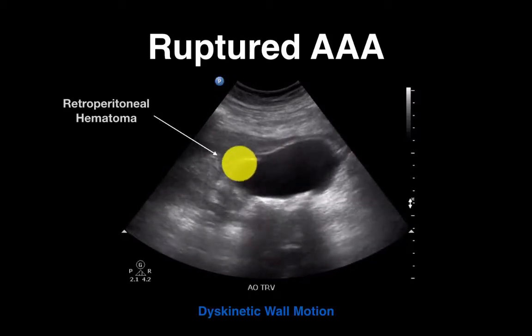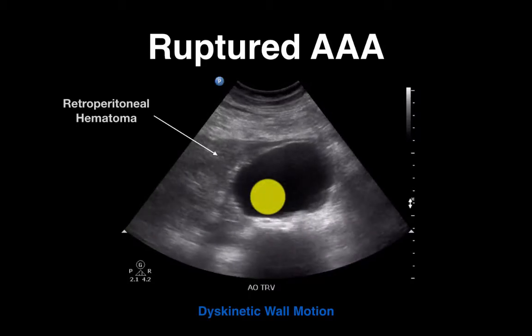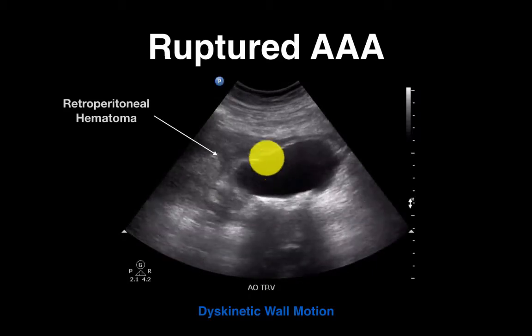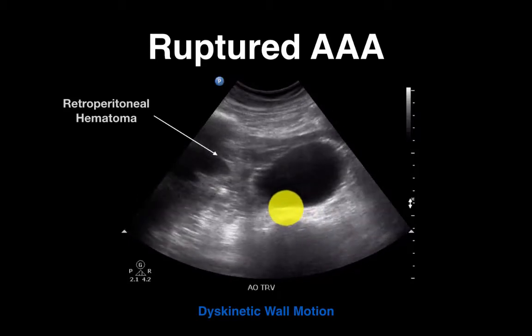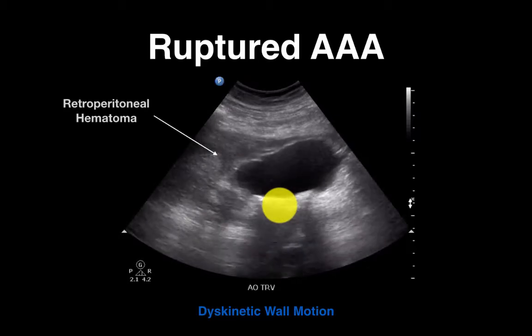First of all, this aorta is shaped in this really unusual fashion. It looks like a pear, but it's not nice and round. It moves in this really funny way. Right? You can see it's kind of moving in systole and diastole here, but maybe not so much over in here. So this is kind of that regional wall motion abnormality that I mentioned.